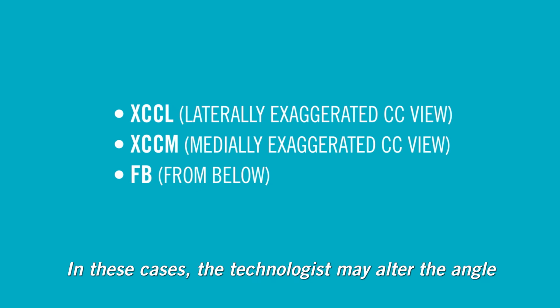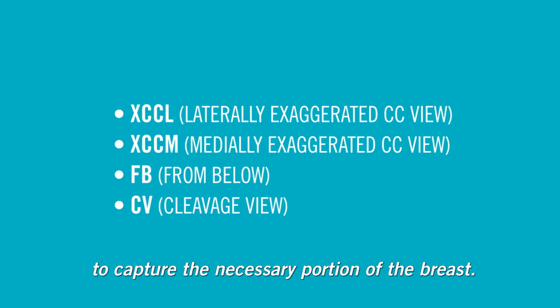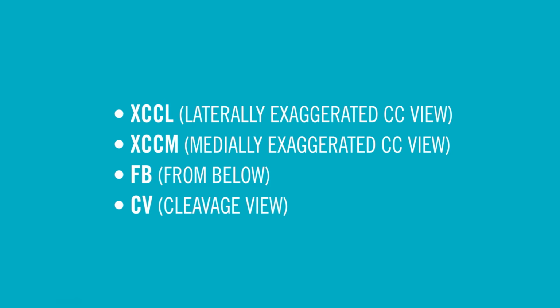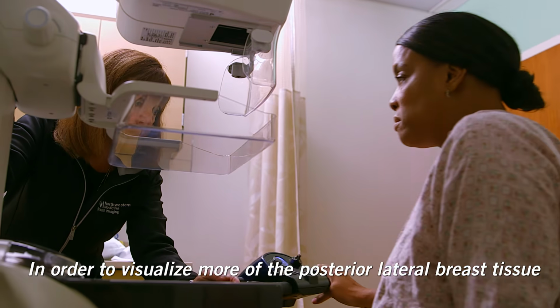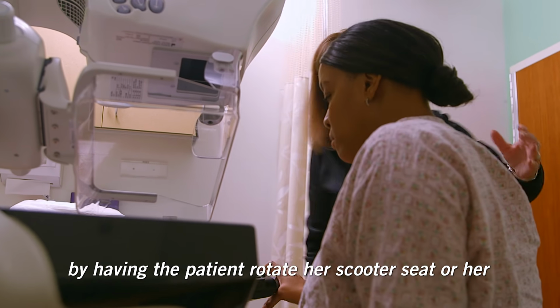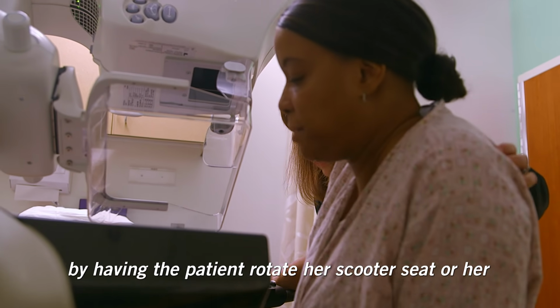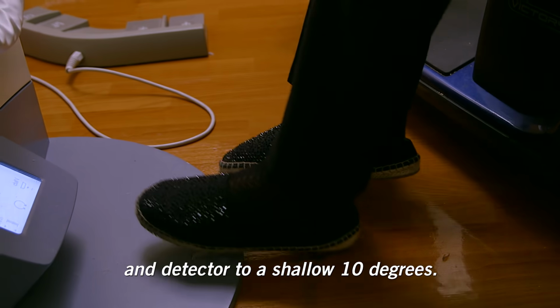In these cases, the technologist may alter the angle of the X-ray tube and detector or have the patient rotate to capture the necessary portion of the breast. In order to visualize more of the posterior lateral breast tissue, the technologist obtains a laterally exaggerated CC view by having the patient rotate her scooter seat or her upper torso, as well as angling the X-ray tube and detector to a shallow 10 degrees.